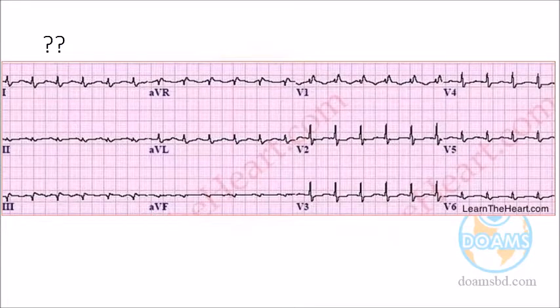Be connected, doctor. Yeah. I think here it is right ventricular hypertrophy. So if you calculate, the R is bigger than S. Yes, the depths. R is bigger than S. Right ventricular hypertrophy. Yeah. There is some other thing also to be discussed. Anybody else to tell something? In V1, R is bigger than S. You can say from here, R is bigger than S. Yes, especially in V2.